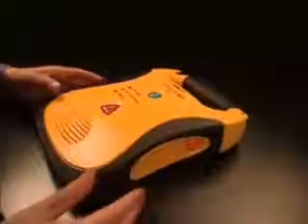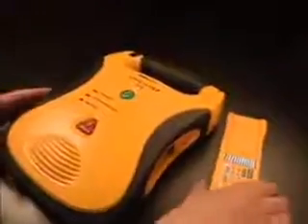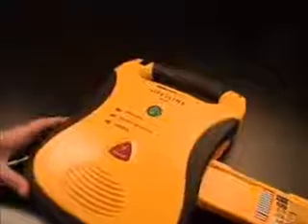The Lifeline AED is powered by a long-life replaceable lithium battery pack. Insert the battery pack into the Lifeline AED by pushing it into the battery compartment, label side up, until it clicks into place. If the battery pack is inserted upside down, a stop will prevent it from going in all the way. If a 9-volt battery is installed in the battery pack, when the battery pack is inserted, the Lifeline AED will automatically run a self-test to confirm the battery pack is ready to perform a rescue.